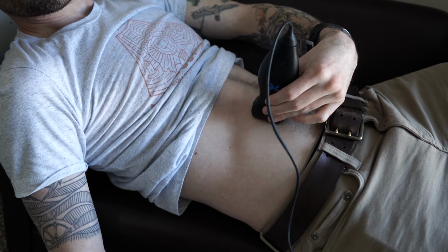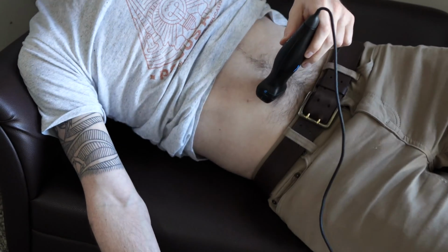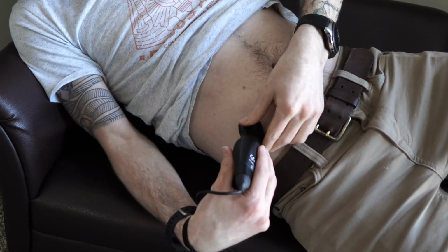The depth of this pocket can be augmented by rolling the patient onto their hip in the right or left lateral decubitus position, placing the target fluid pocket in the more dependent position.